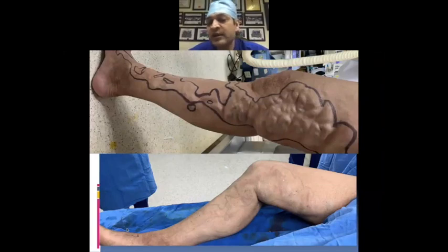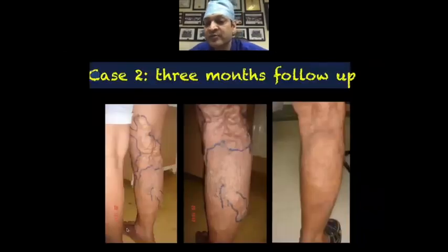So here the patient is still lying down, and you can see we have done the foam and the laser, and there are no cuts, of course no stitches, and you can see the size of the varicosities which is there. And when these patients come, we give the compression bandage, of course. There's another case where we have done the laser and the foam, and microfoam was also done in this, and you can see around 3 months follow-up, you can get fantastic results.